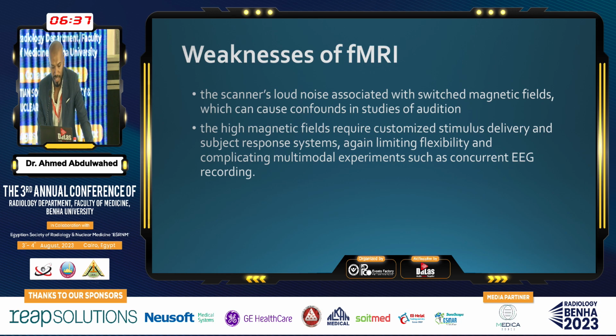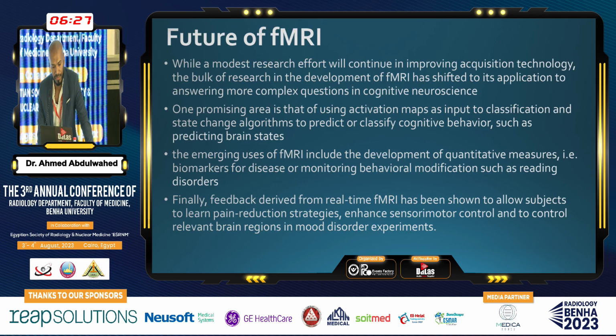The high magnetic fields require customized stimulus delivery and subject response systems, again limiting the flexibility and complicating multimodal experiments such as concurrent EEG recording at the time of scan.